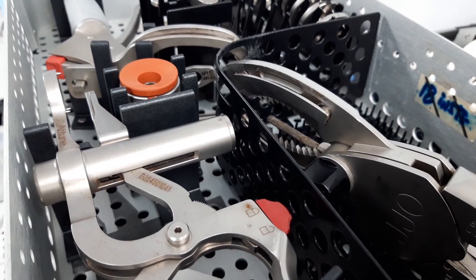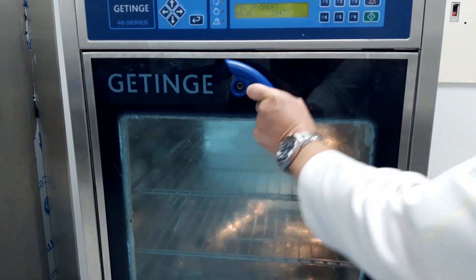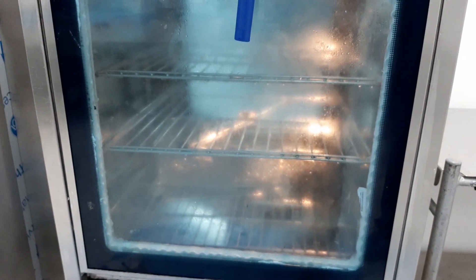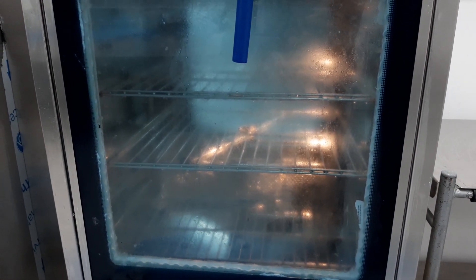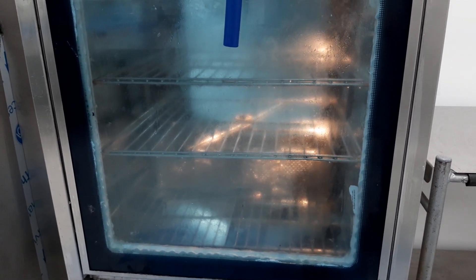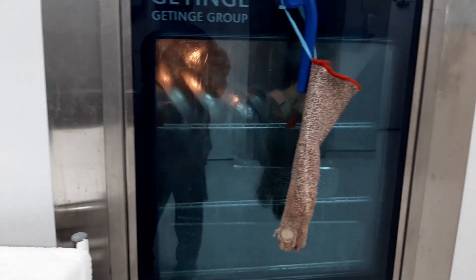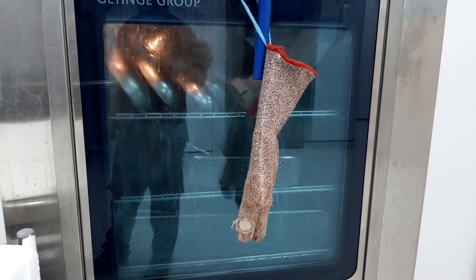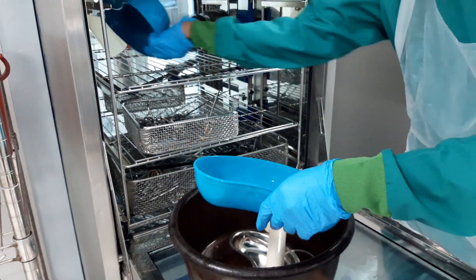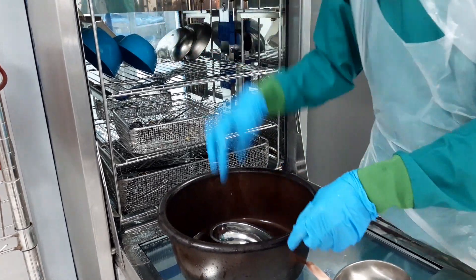A typical washer disinfector cleans surgical instruments using the following five stages. One is flushing, to remove both solid and fluid gross debris contamination. Second is washing, to remove any remaining debris contamination. Then rinsing, to remove the detergent used during cleaning. Next is thermal disinfection, where heat is used for a specific time to disinfect the instruments. And the last is drying by hot air, used to dry the instruments.